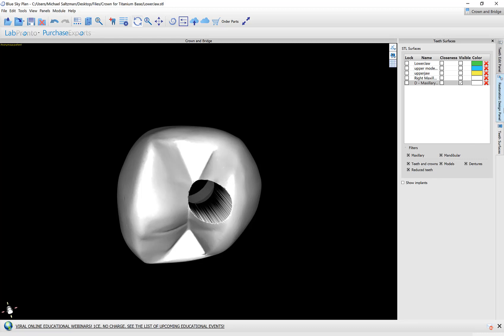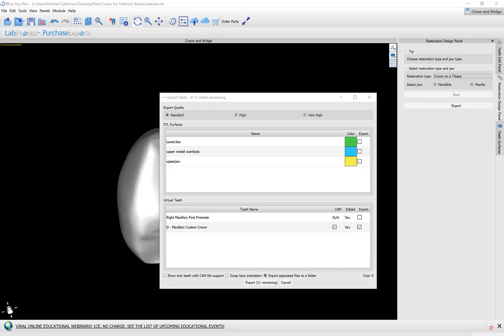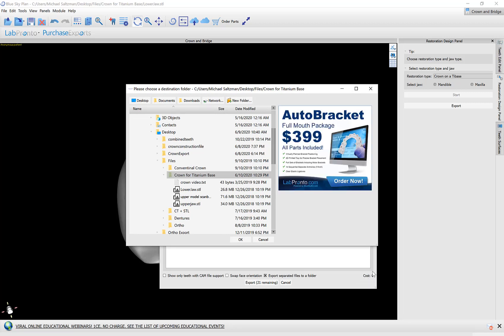At this point when we finished the design process the export button appears automatically. And when we go ahead and click on it we could see our surfaces available for export. So here we have our custom crown with the D that's the designed one. And we have the option to export it to an STL file which is checked in the export column. And we have the CAM column which when checked will create the XML configuration file that can be sent to the milling machine to mill the crown. We have the export button that shows how many exports we have remaining. It's also important to note what we see here is cost is zero. So as I mentioned at the beginning there is no cost to design and there's no cost to export to mill the crowns or to export them to an STL file.